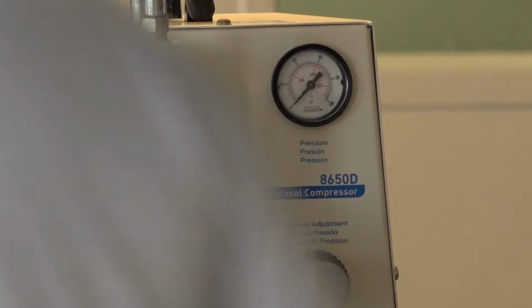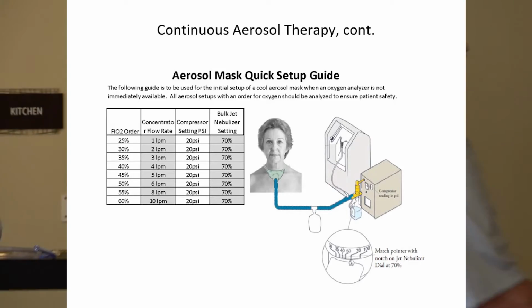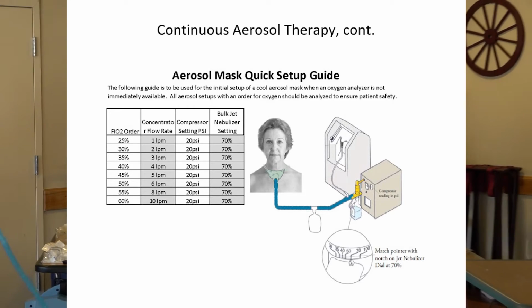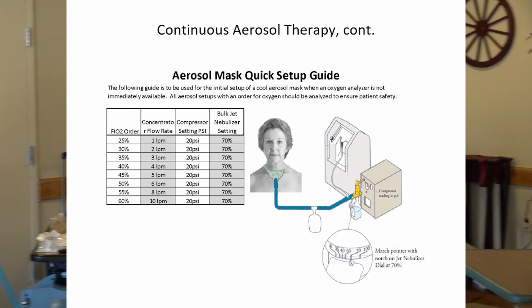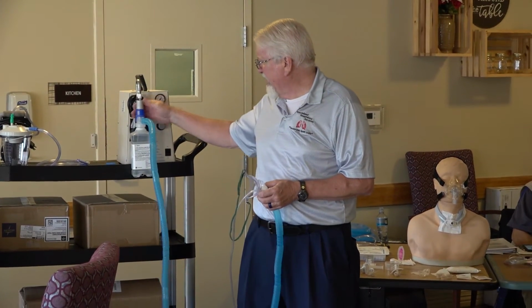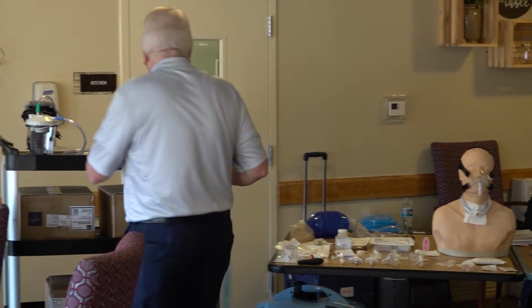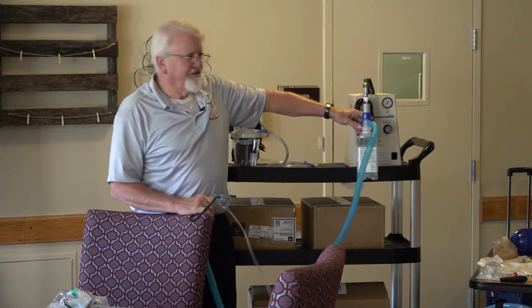Actually, it may say on that, I'll go to the next slide. What does it say for the pressure setting? 30? Yeah, 20 for pressure setting. Okay. Yeah. So your pressure setting. And then the next thing we have here is the neb cap. You'll notice the neb cap has, I'm sorry I keep moving around, but I feel like I'm not catching everybody.